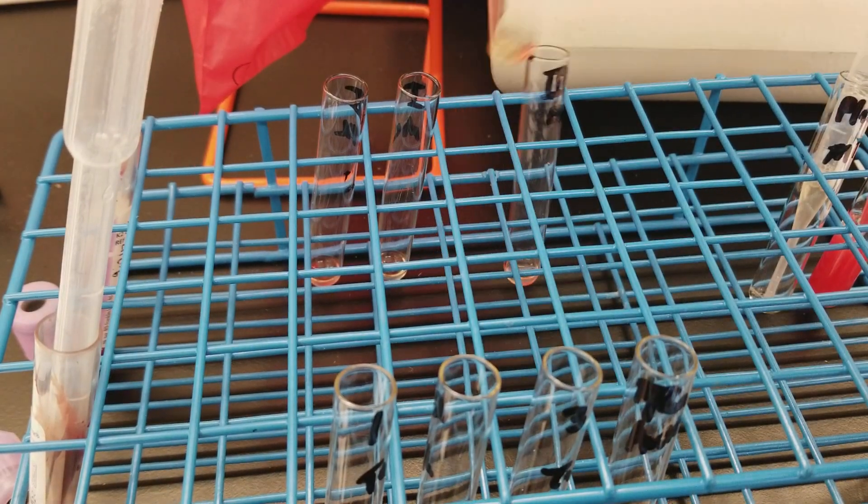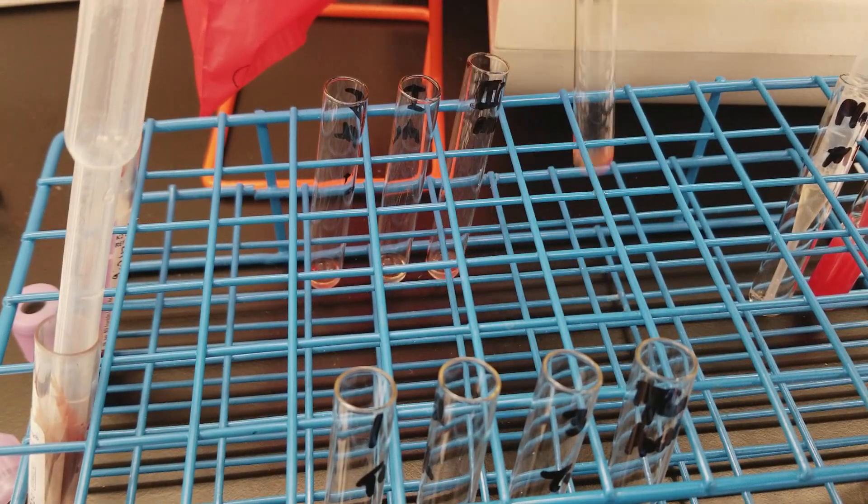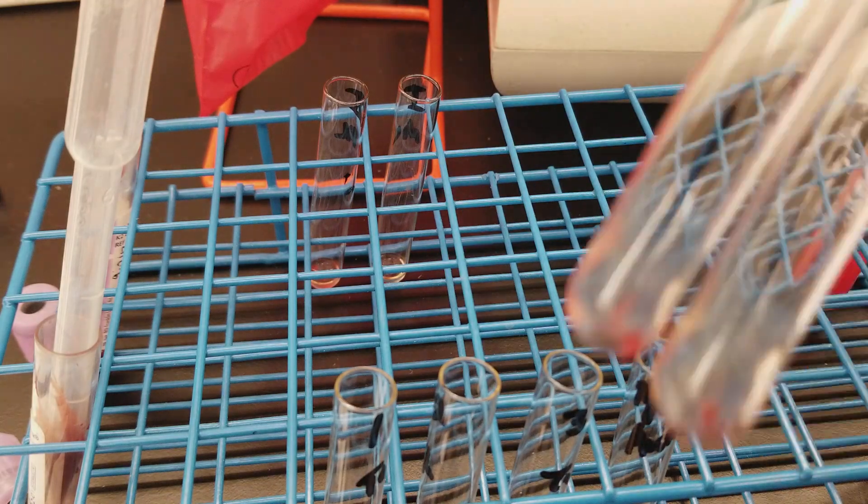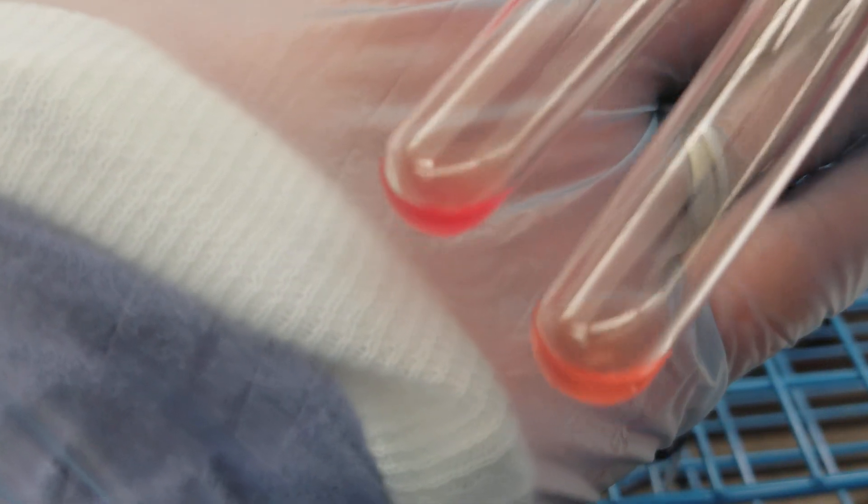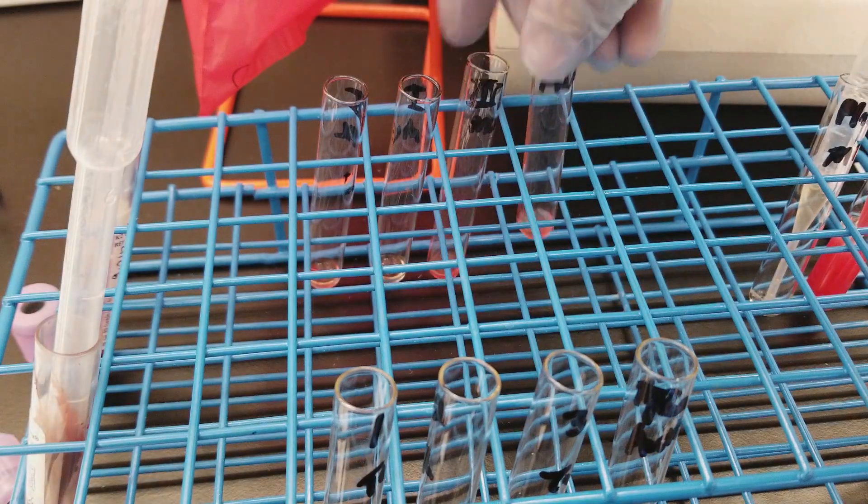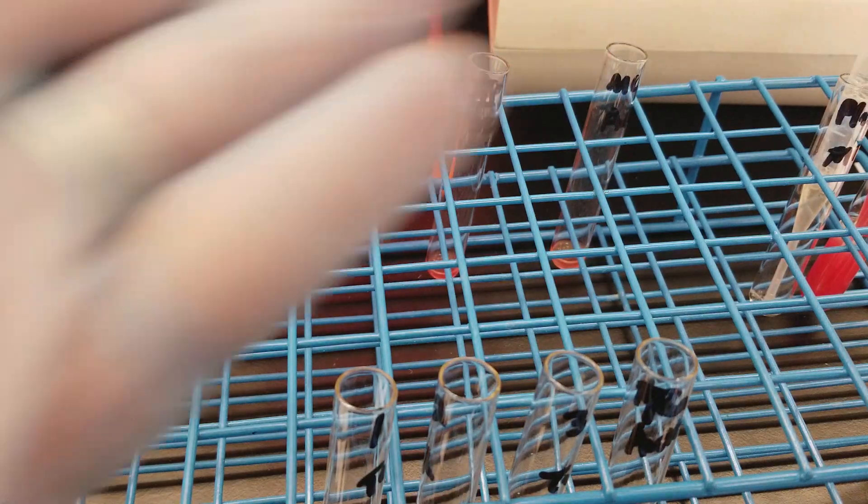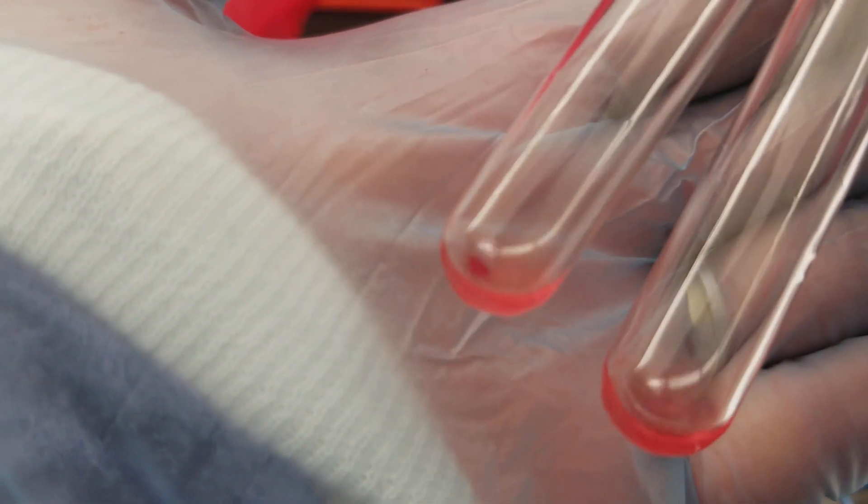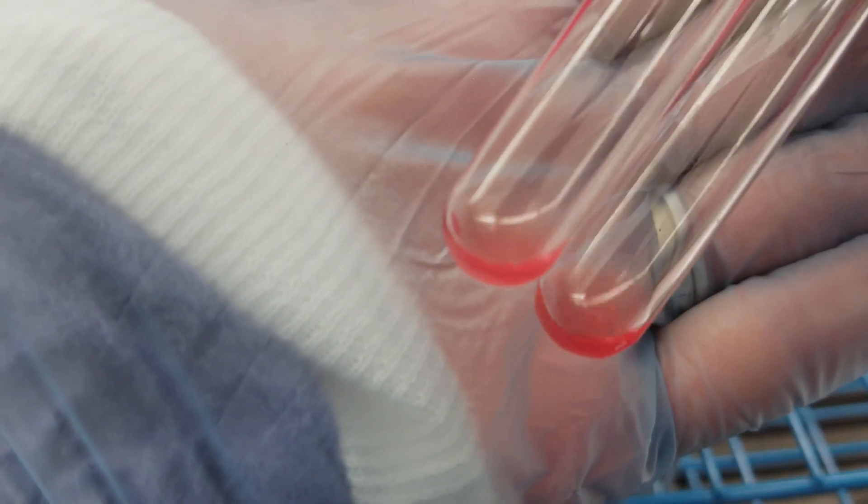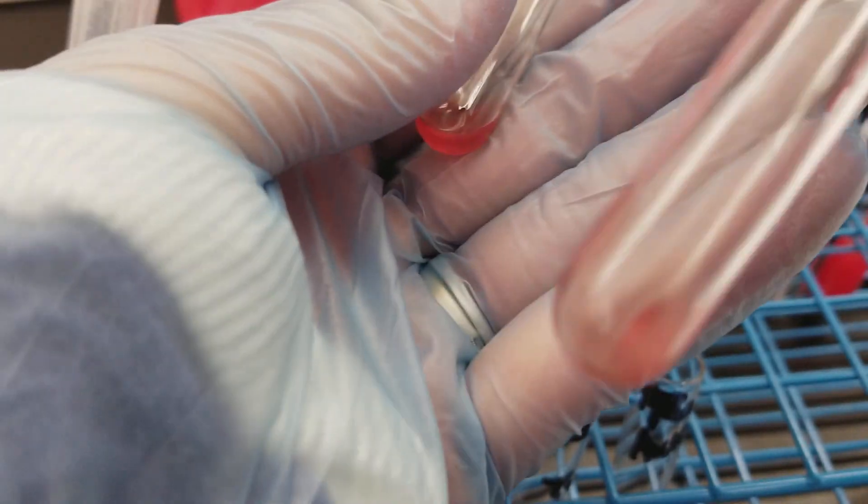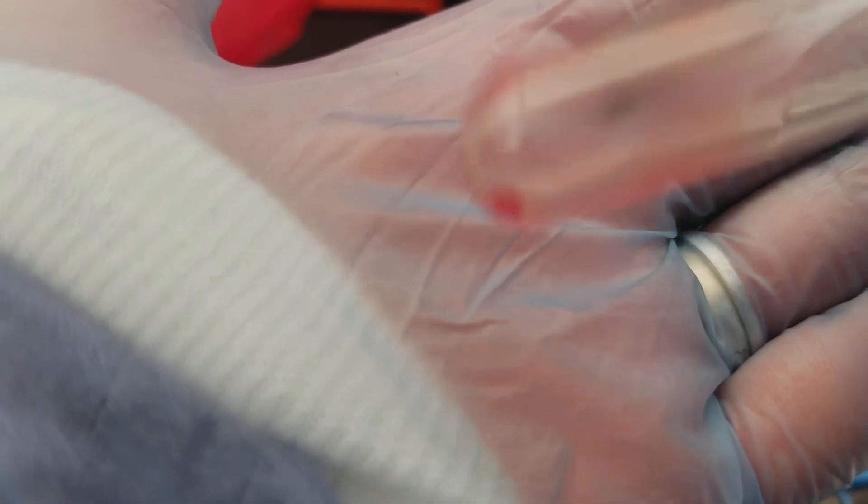So auto controls. Okay, so this is the positive patient - this is auto control and cell three, those are negative. Cell number two is negative, cell number one looks positive.